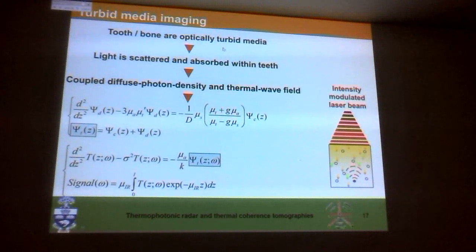Wink, wink, nod, nod. Well, yeah, you can use interferometry, but convince the average dentist that they're going to use interferometry, especially because we're using a 2 hertz modulation frequency here, and the idea was to use multi-frequency, maybe to stay on the tooth for about 3 or 4 seconds, and go 1 second per tooth and then go out, everything else, I lose money.